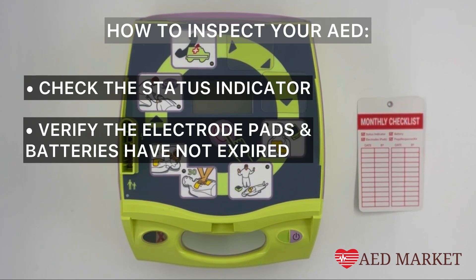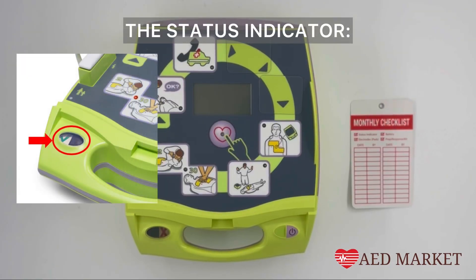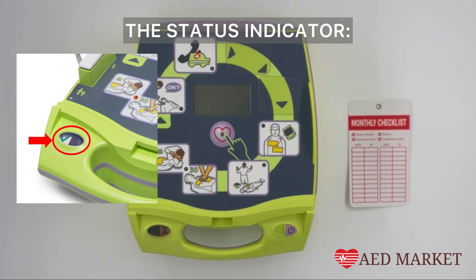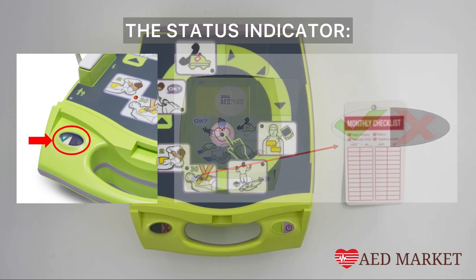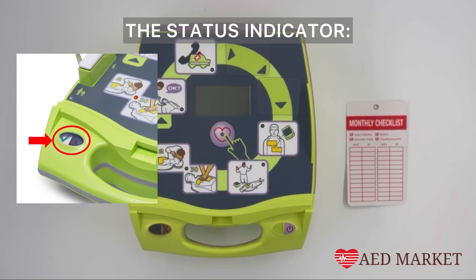Your AED performs a self-test weekly and monthly to ensure its functionality. The status indicator quickly shows whether the AED has passed its self-test and is ready for use, displaying a green check for readiness or a red X if servicing or replacement of consumables is needed. This is why regular inspections of the Zoll AED Plus are essential.